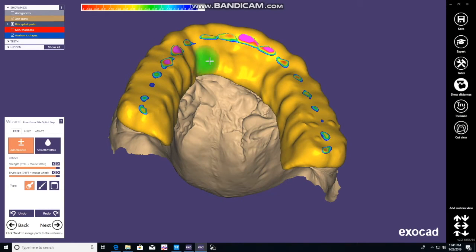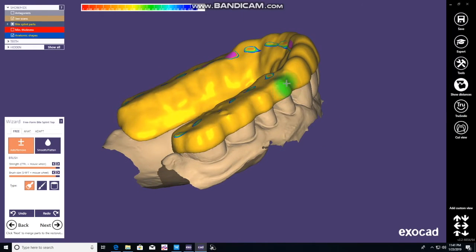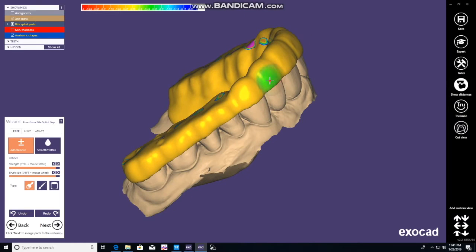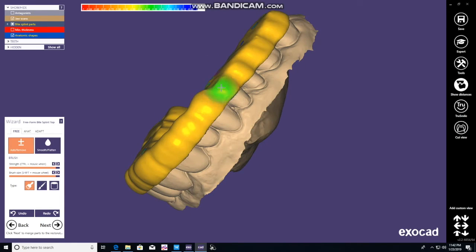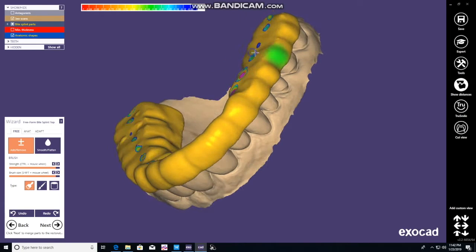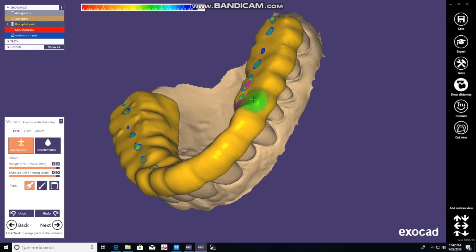Even on the buccal surface so they don't break as easily, you can add that. Obviously be careful making it too thick — patients don't want a big bulky appliance in their mouth and they may not wear it. What we're mainly doing here is in between the teeth and the embrasure areas. Go along clicking that and thickening it.